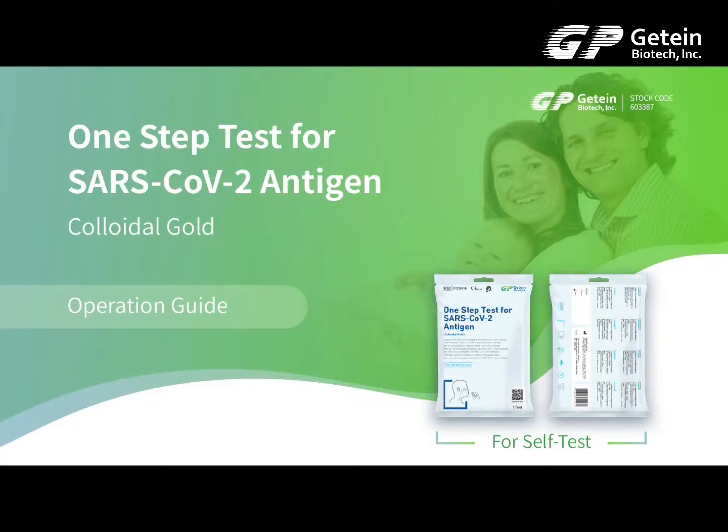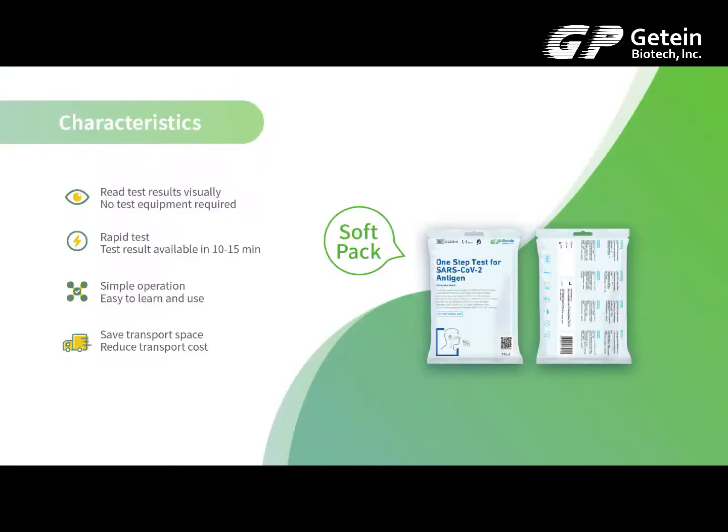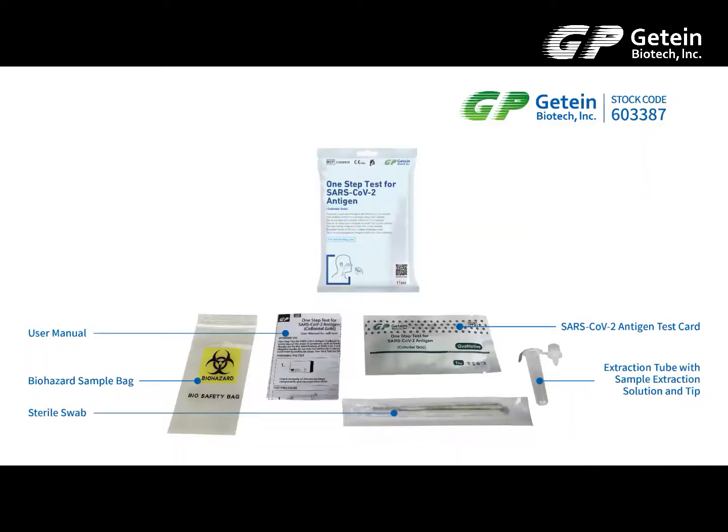One-step test for SARS-CoV-2 Antigen Colloidal Gold. Operation Guide. Test Kit Contents. Test Procedure.